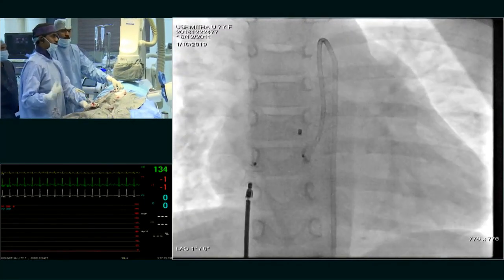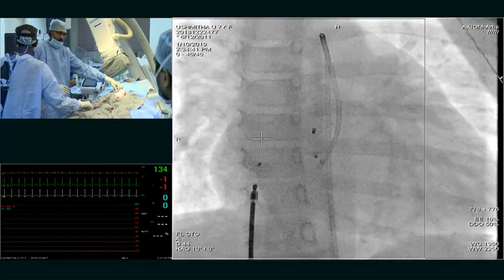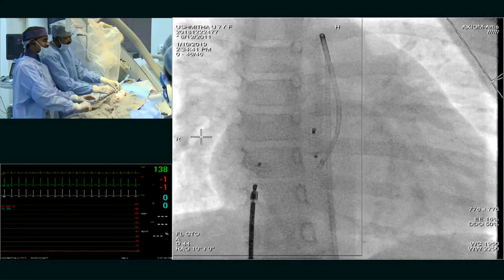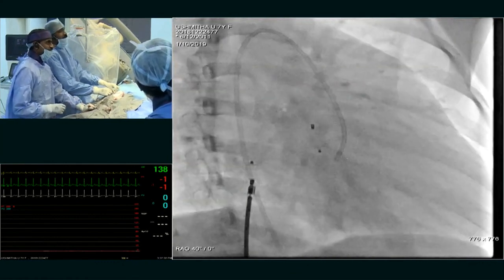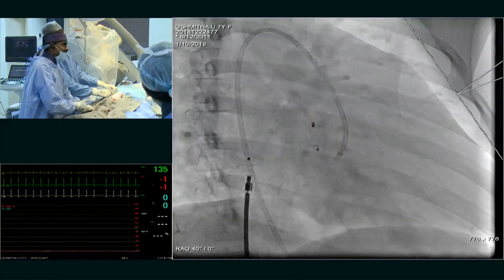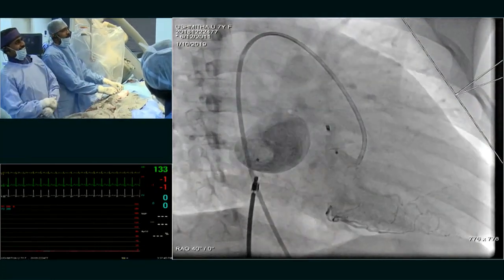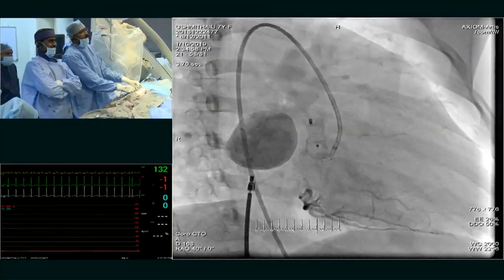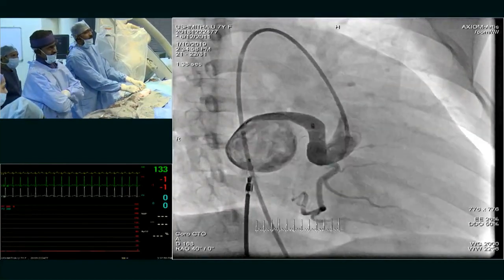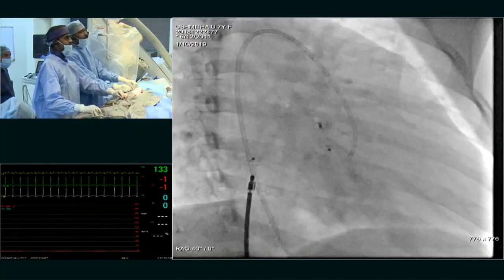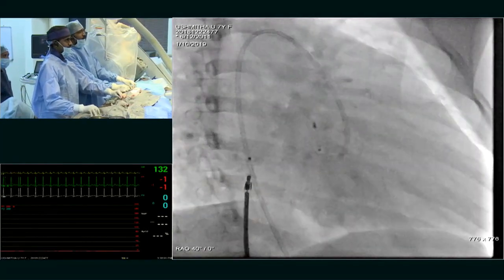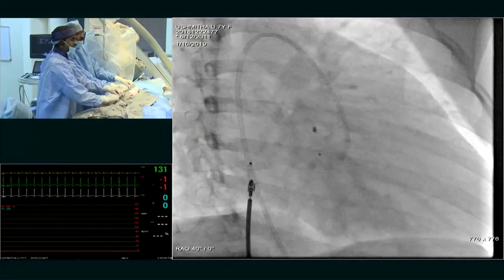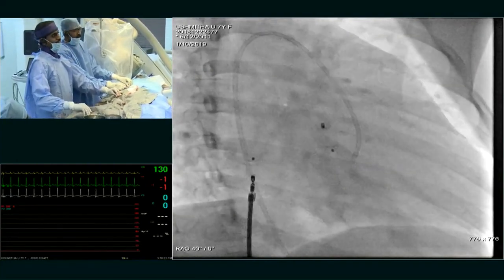Can you give me RAO? Keep the radiation screen there — Damien told me in the morning to use the radiation screen. There is a conduit case standing in the other lab, coming in a few minutes.